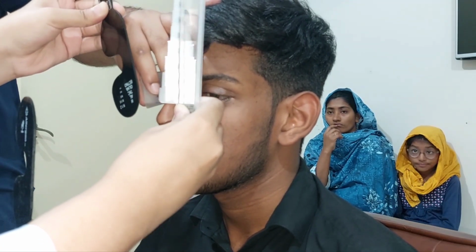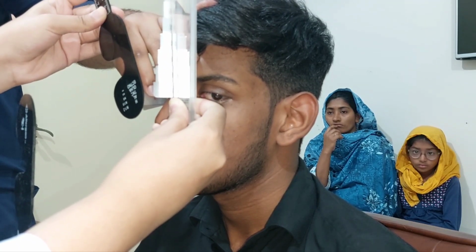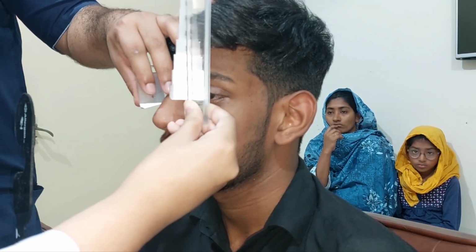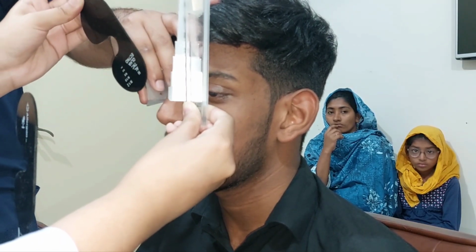Okay, so you cover one eye and then you switch the cover to the other eye. Alternate cover test while kindly keep the prism bar close to the eye. Straight in the frontal plane of the eye. So it should be as close as possible.